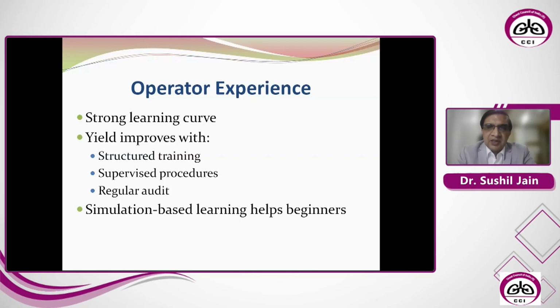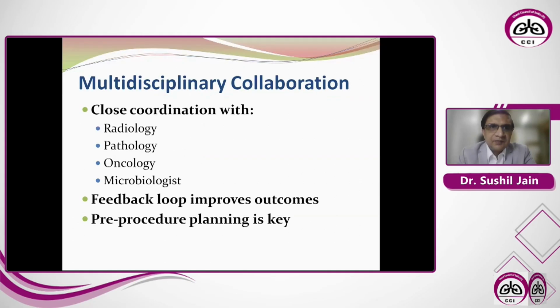And simulation-based learning helps the beginners. So we should make sure that when we are learning EBUS TBNA, we try simulation-based learning, and then gradually move on to do it in our own patients. Coming to multidisciplinary collaboration, we all need to understand that if we have a close collaboration with our radiologists, pathologists, oncologists, and microbiologists, our learning curve improves, our feedback loop improves our outcome, and pre-procedure planning becomes a very important key factor to decide how well we perform a procedure.